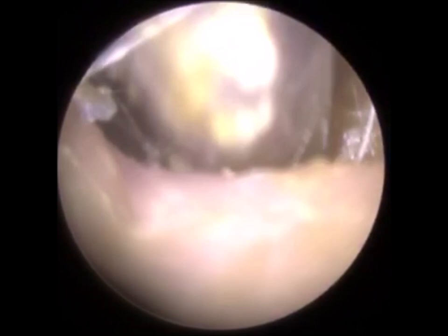You will find, I'm not sure where it is in the video, that with this dead skin, when you lift it off the canal wall, you get what we call contact bleeding. Think about if you've got a blister on your finger and you're peeling off dead skin, you can sometimes get bleeding. It's purely due to the skin being adhered to the canal wall, and that compression. Imagine this big plug of dead skin in the ear, growing and expanding, and the amount of compression in this ear. That was what was causing this gentleman's otalgia, his earache.